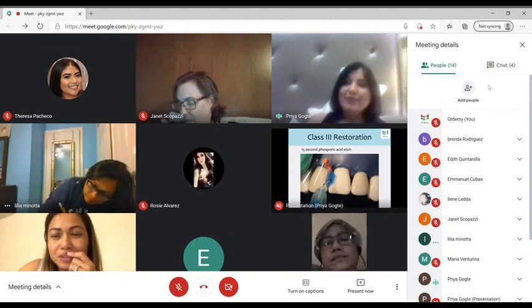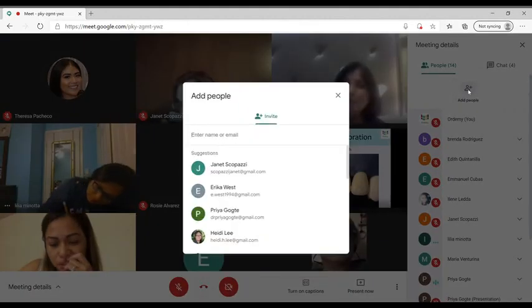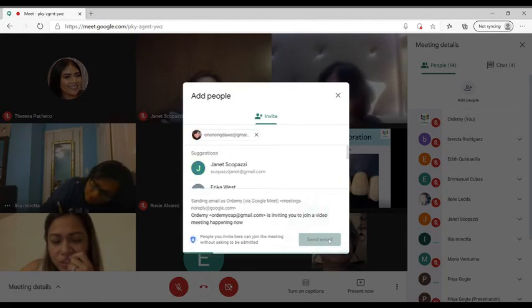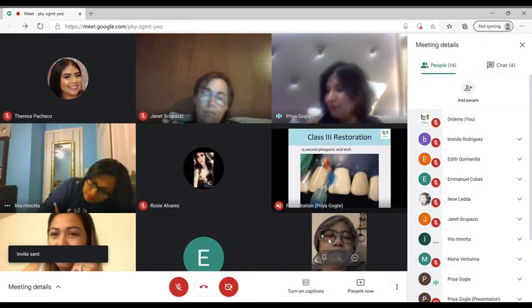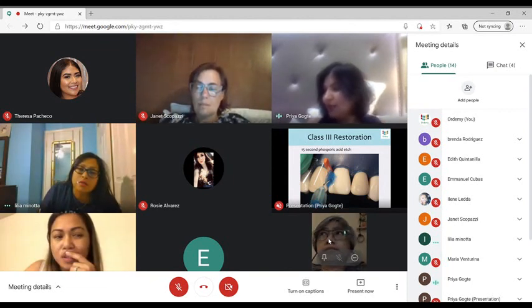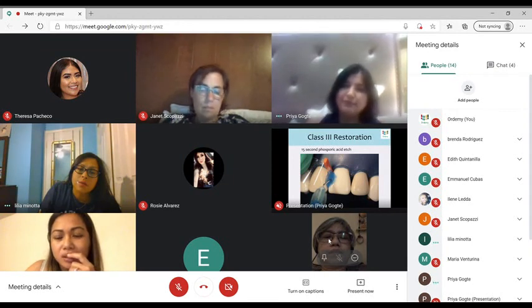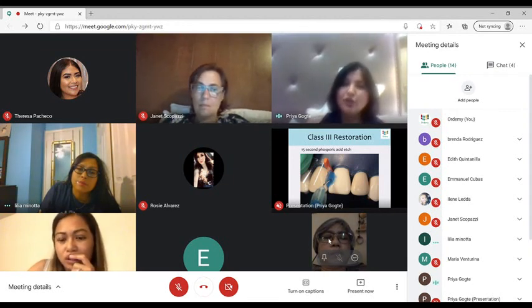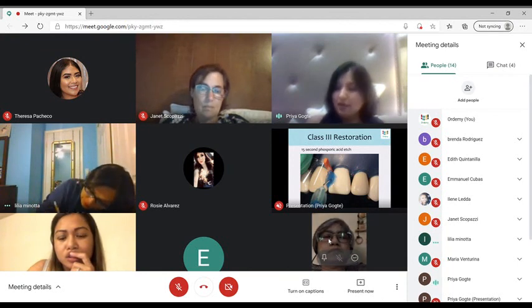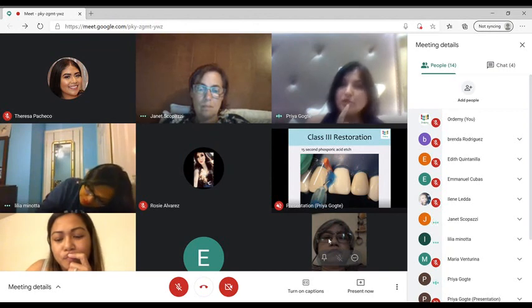Can anybody tell me how much you want to air dry it? You want to air dry it to an extent where there is no pooling of water, but you don't want it to be chalky.